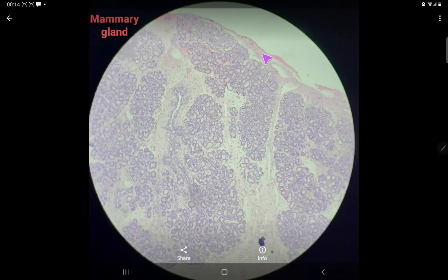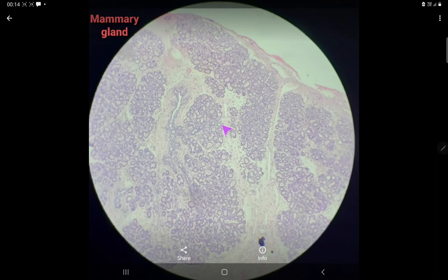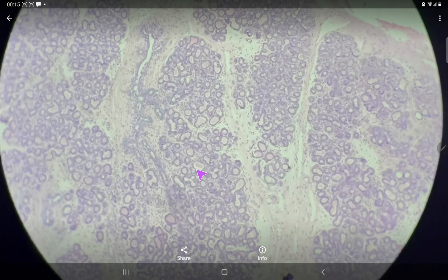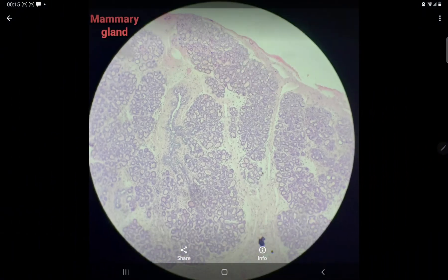In summary, in the mammary gland you will find connective tissue stroma separating the glandular part. The glandular part varies according to the stage: in the inactive stage, the glandular part is less and indistinct. In the pregnant stage, the glandular part is more and connective tissue is less, but there is no secretion inside the glandular part. In the lactating mammary gland, you will find some secretion in the alveoli. So, you can clearly and easily identify this slide as belonging to a lactating mammary gland.